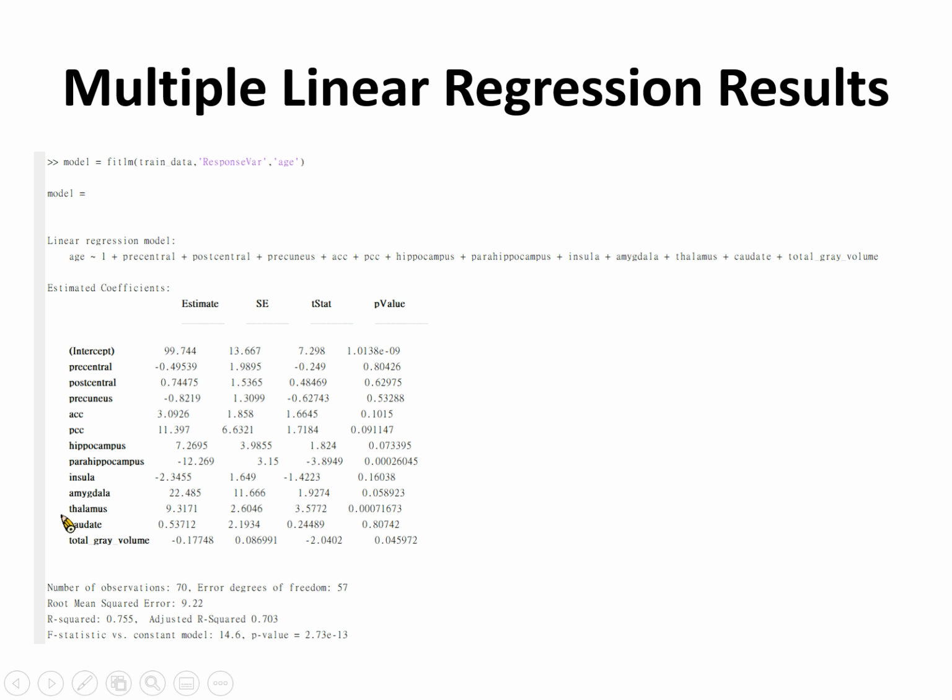And likewise, the thalamus, because the thalamus is the center for any sensory inputs. So it is just like an information center. So when we get older, the thalamus should have more volume because it needs to process so much information. But for this model, you can see that only a few brain regions contribute to predicting brain age.